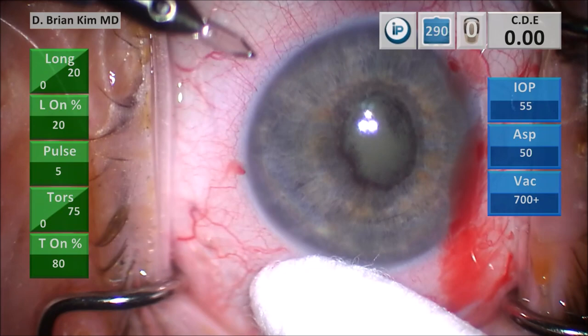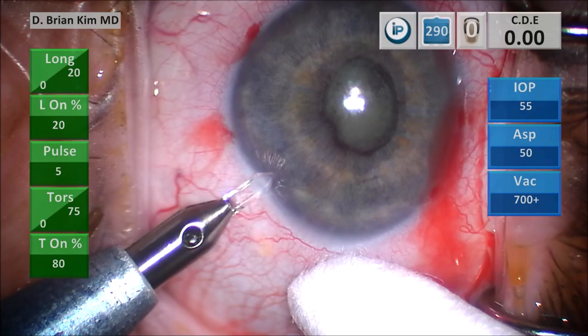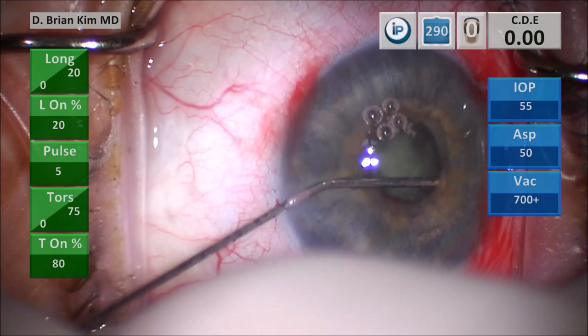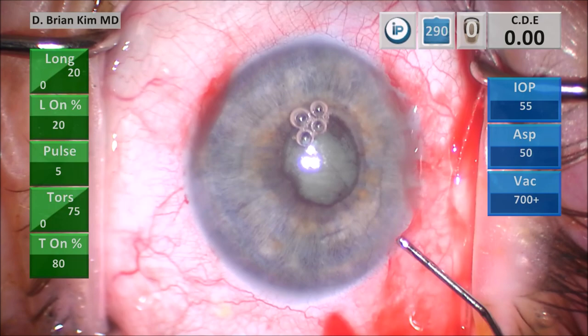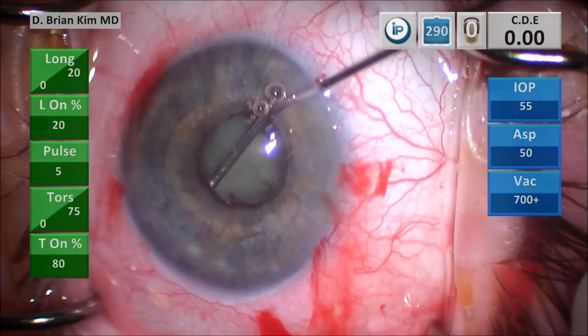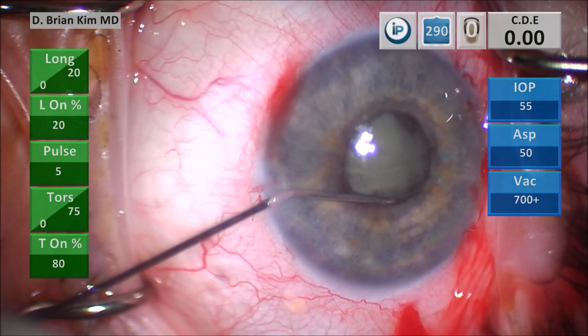I'm going to put four fairly equidistant incisions, and then reserve a fifth incision for my sub-incisional iris hook — through the episclera, directly flat and parallel to the iris plane. I'm injecting intracameral lidocaine and epinephrine, and I went underneath an edge of the pupil and started to bluntly dissect around it. Taking advantage of all those incisions, I'm going circumferentially and bluntly dissecting the posterior synechiae off the anterior lens capsule. This blunt dissection is very safe — I haven't torn the capsule in the process of removing the adhesion.